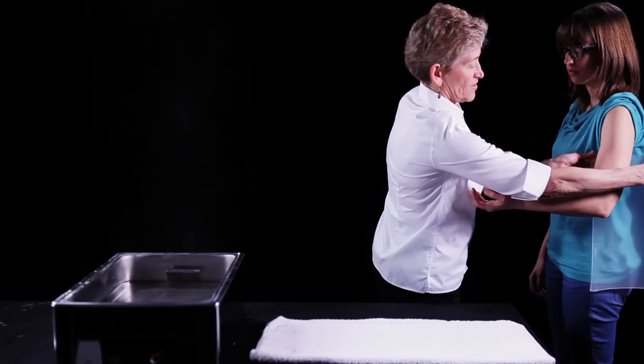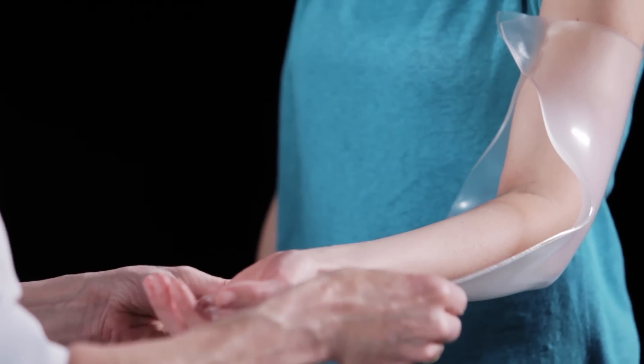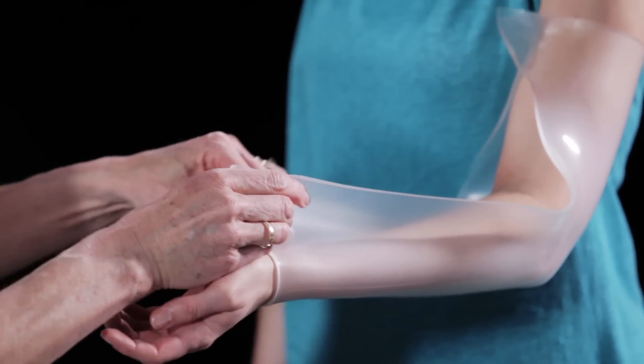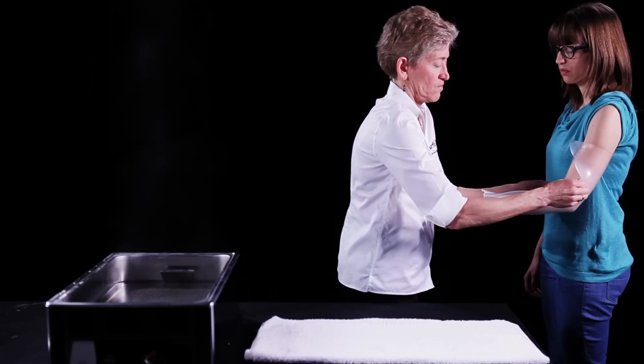Place the thermoplastic material behind the patient's upper arm and stretch the corners around the arm to pinch together in the front. This acts to anchor the material in place. Stretch the material distally to pinch at the level of the wrist.